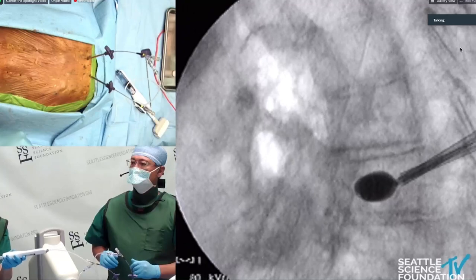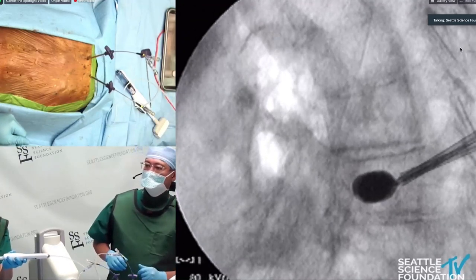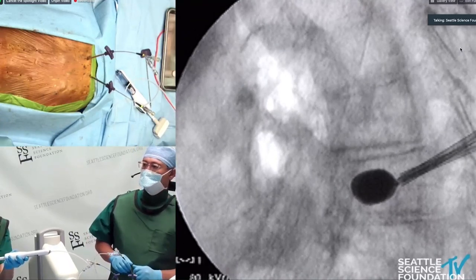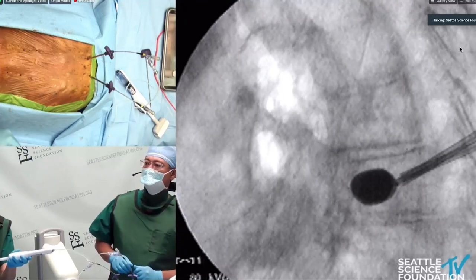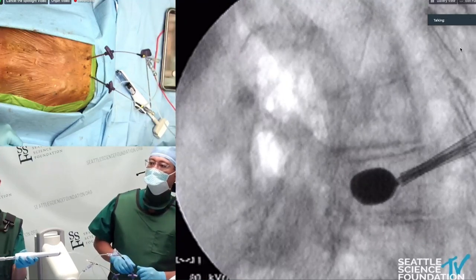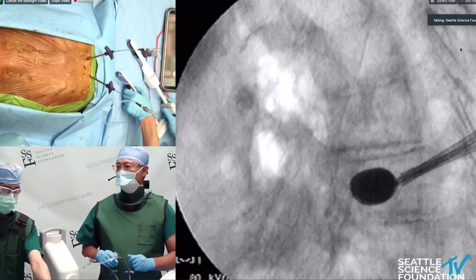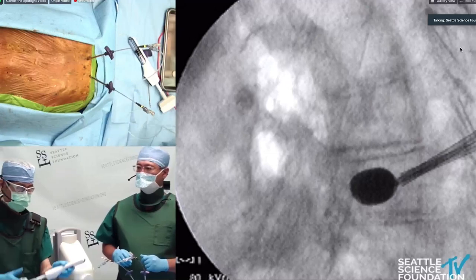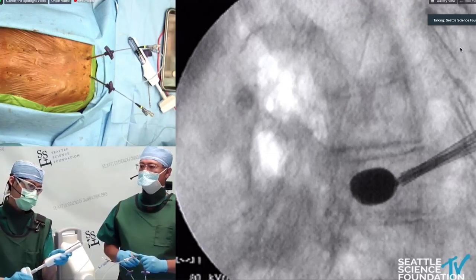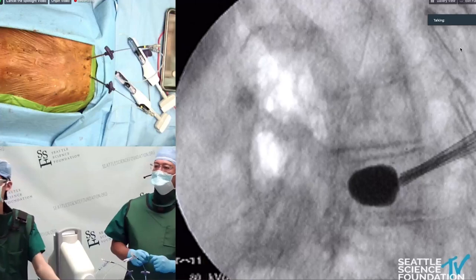As you can see, the balloon is enlarging — making sure it doesn't get too close to the anterior border. That looks good, stop there.